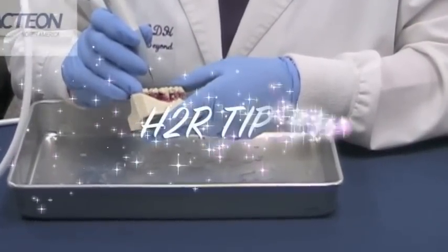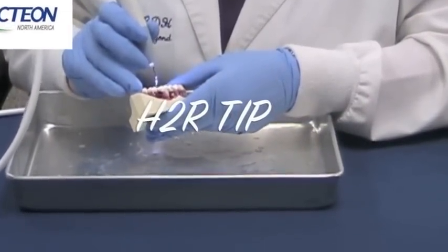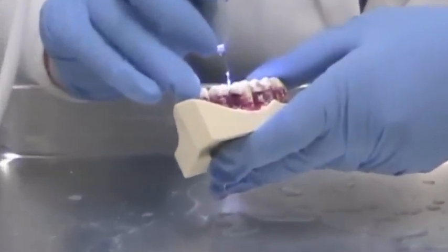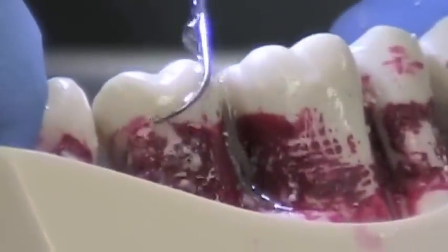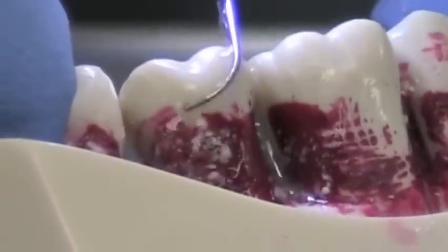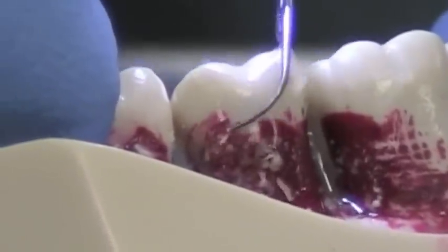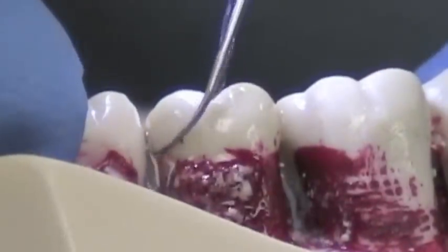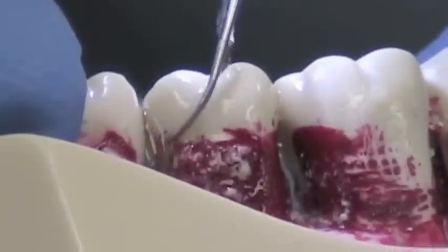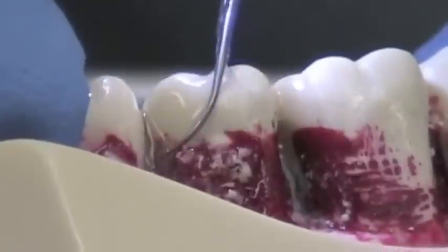Now we're going to demonstrate the H2R tip. The H2R tip is again a diamond coated tip used for the posterior teeth. As you can see, I'm on the buccal — kind of roll the instrument right into the lingual very, very lightly. Again, you're doing conservative root planing and you can remove burnished calculus.